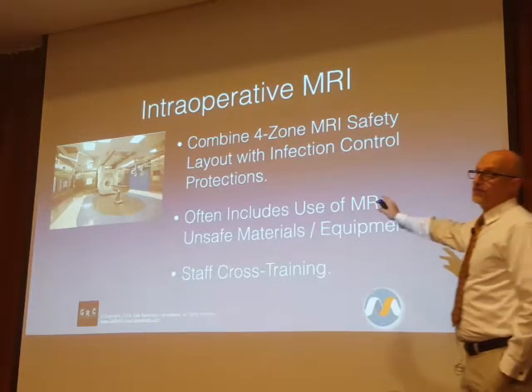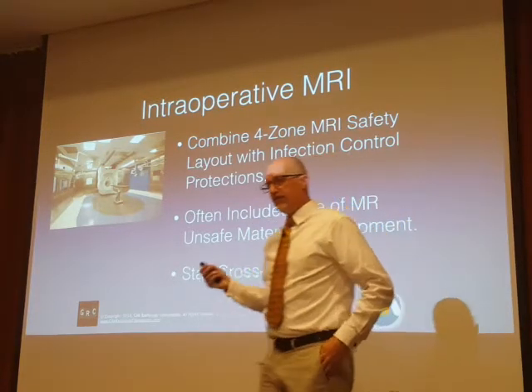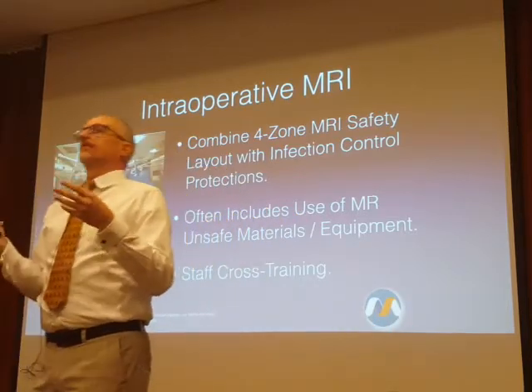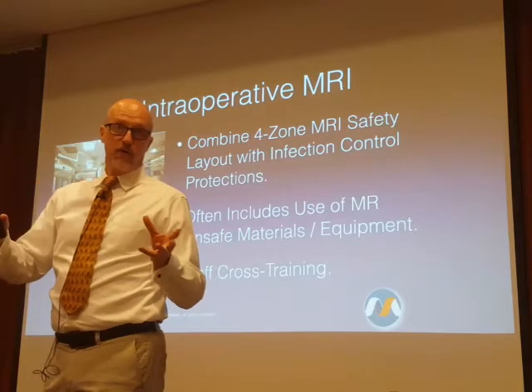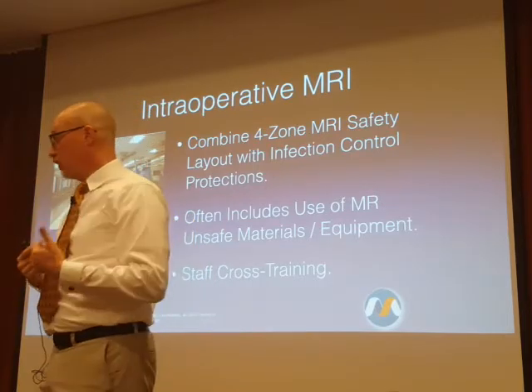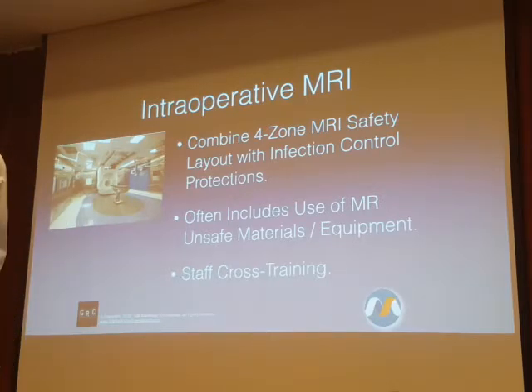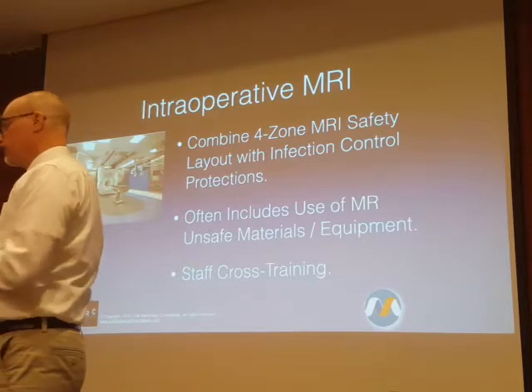So this is similar to the PET MR, because here we have infection control protocols for who has access and when we allow them to have access, what they have to go through to prepare to gain access to the suite. That generally sounds an awful lot like the PET MRI and the PET function. It's just now we're doing it for infection control purposes, which has slightly different mechanics associated with it.